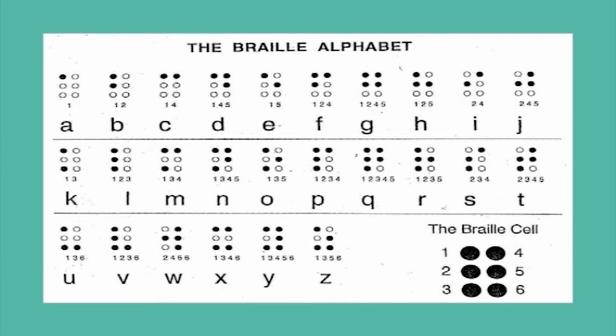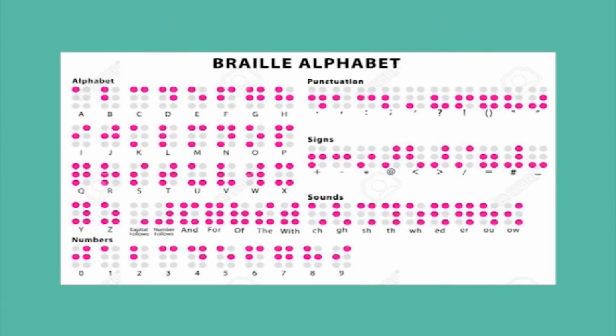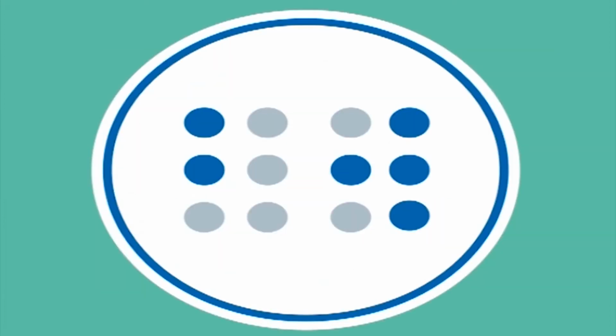The screen reader will then translate the text in Braille and the device will display it on its built-in Braille cells. To create the Braille dots in each cell, Braille displays use metal or nylon pins. Most Braille displays have 8 dots in each cell.